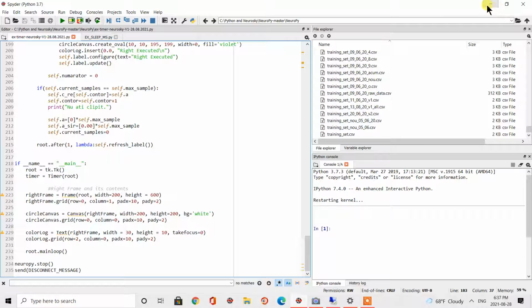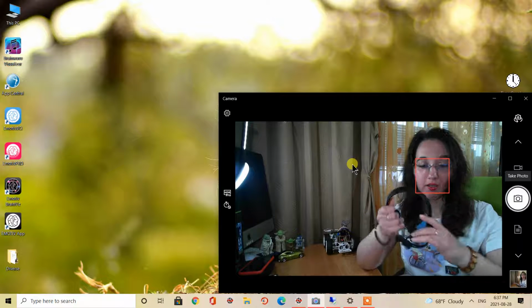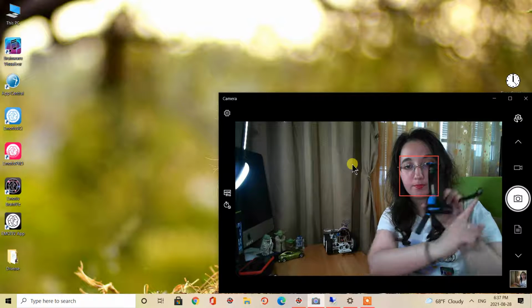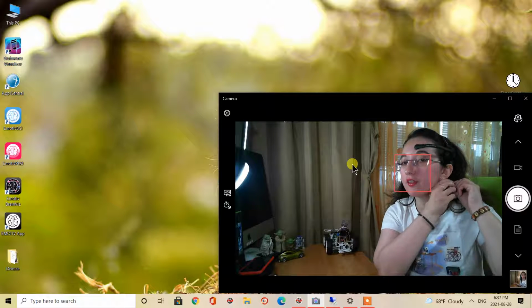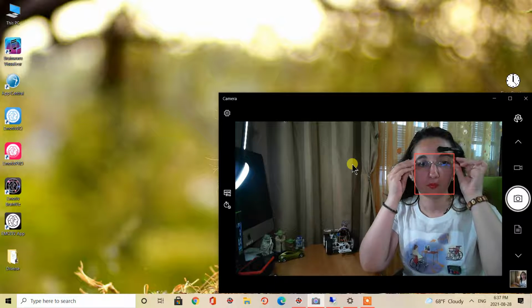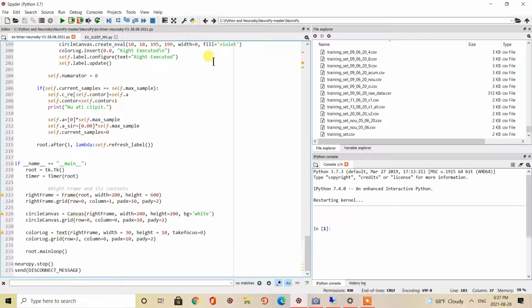Okay, first of all, I will wear the headset. So I will attach it on my head. It contains one single sensor, this one. It should be placed on the forehead at the prefrontal lobe, and the reference or the ground should be attached on the earlobe. The Raspberry Pi is already running. So I should start the Python application that runs on my computer. I will click on the Run button.